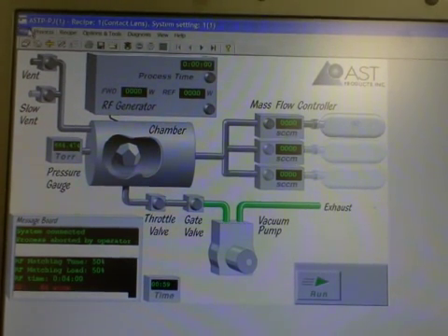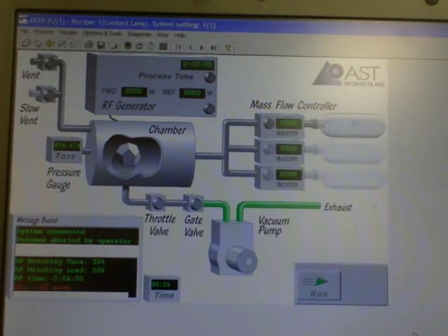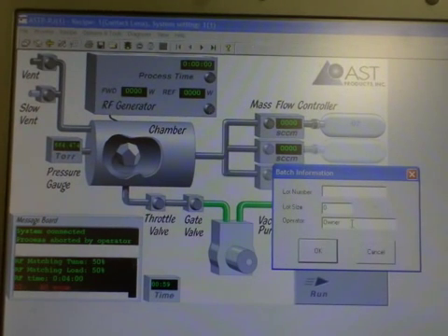The first thing you do is go up to File, then Recipe, and select a recipe. The recipes are preloaded into the system. For contact lenses, hit Select and then hit Run. You're able to put in your lot number, lot size, or operator name so you can keep track and save all your data, then hit OK.